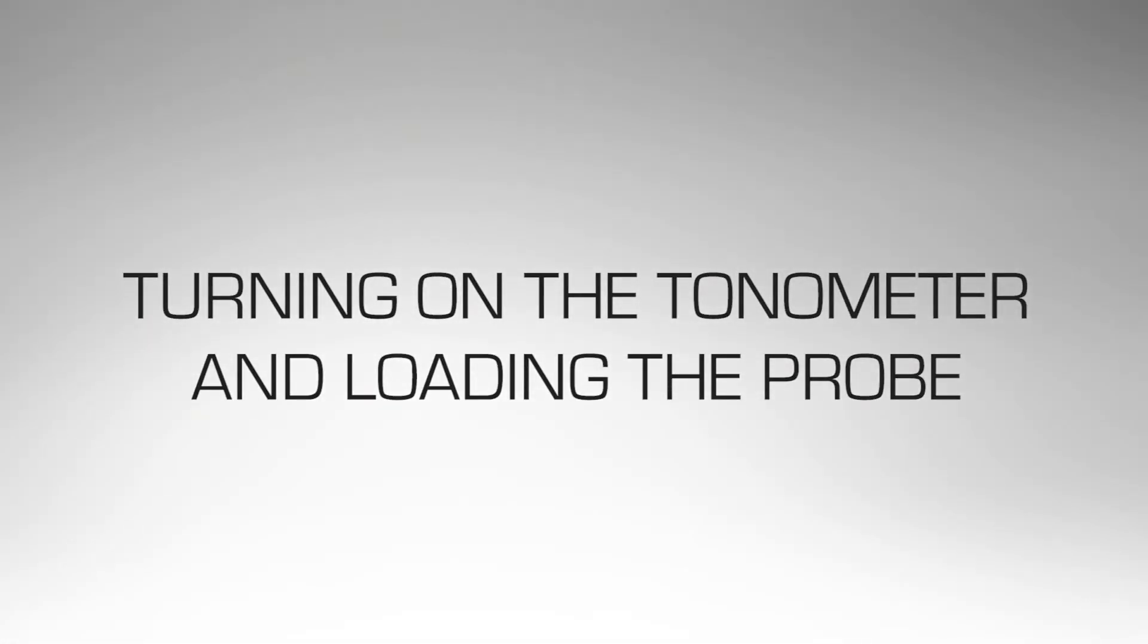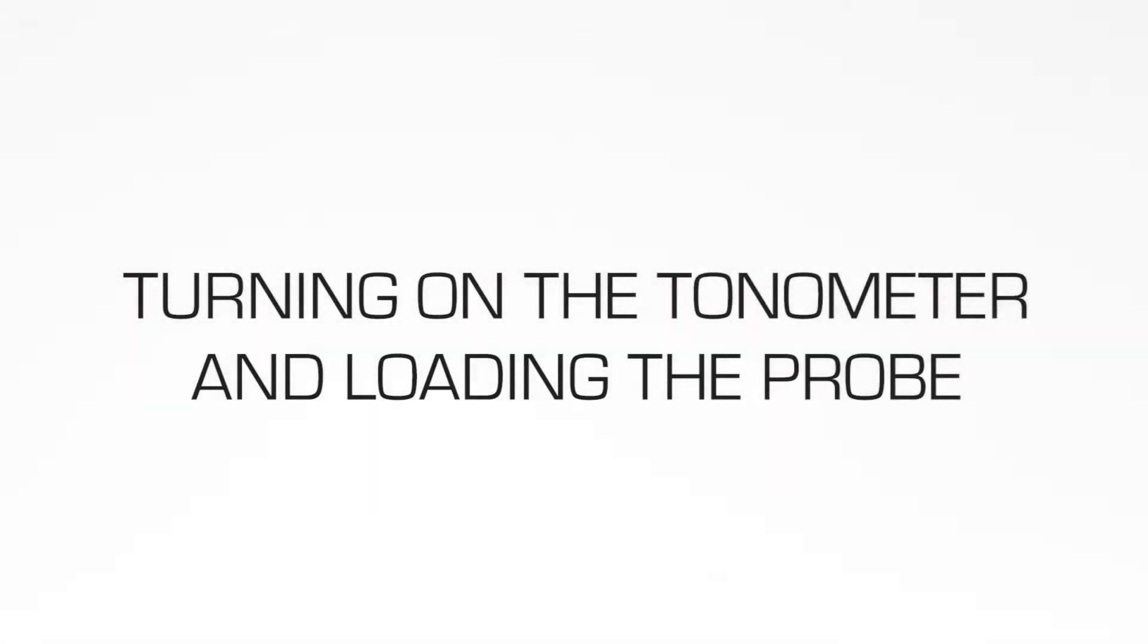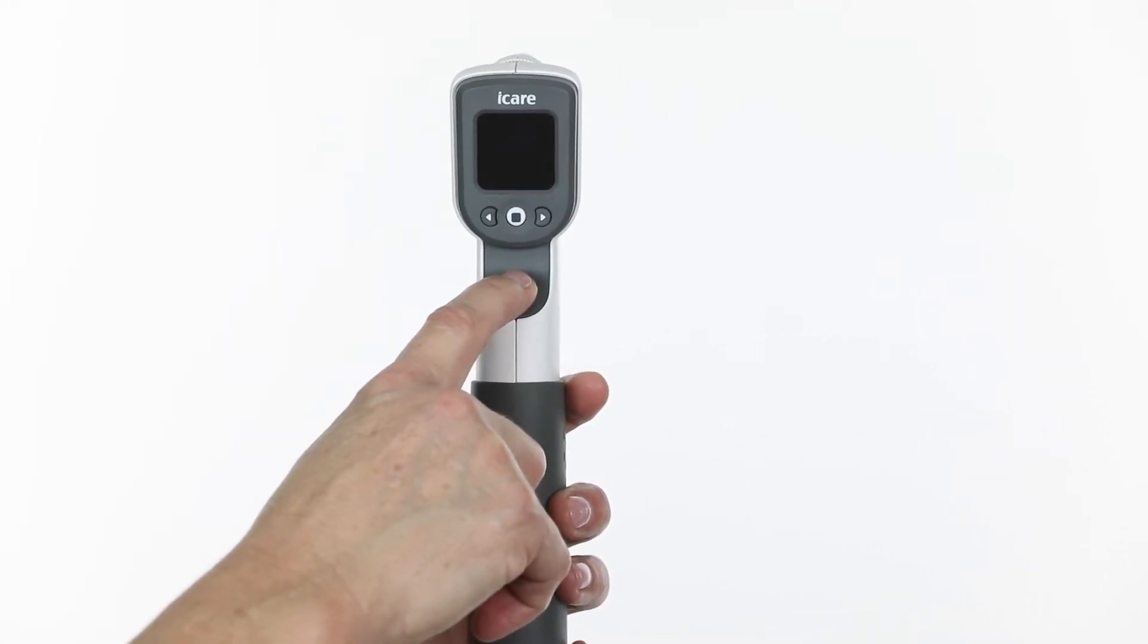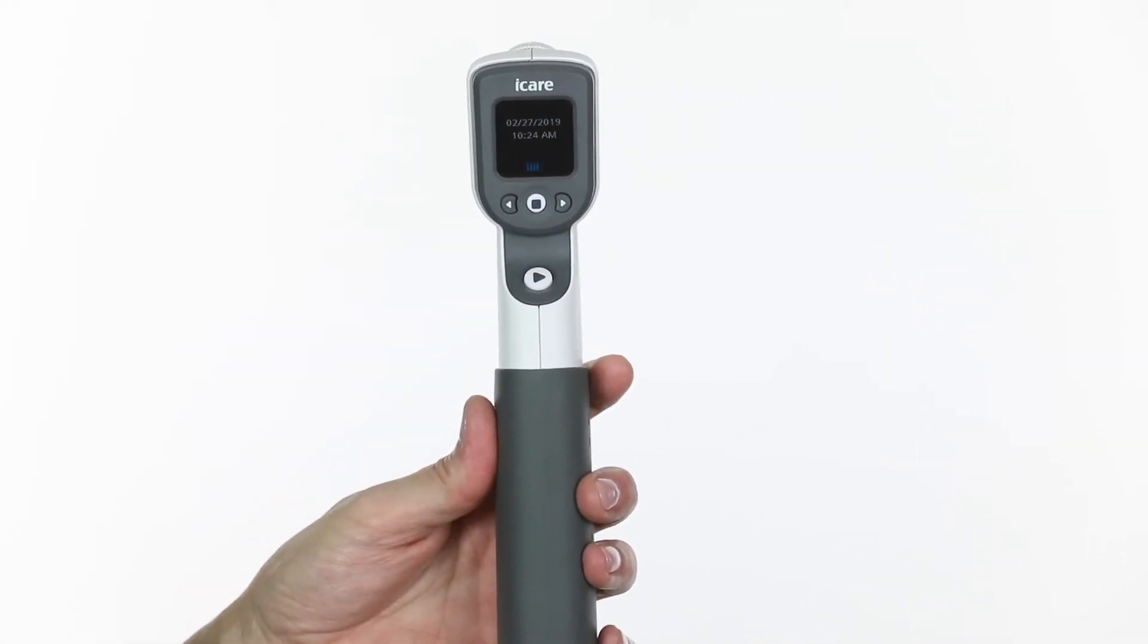Turning on the tonometer and loading the probe. To turn on the tonometer, press and hold the measure button for 3 seconds or until you hear a beep.